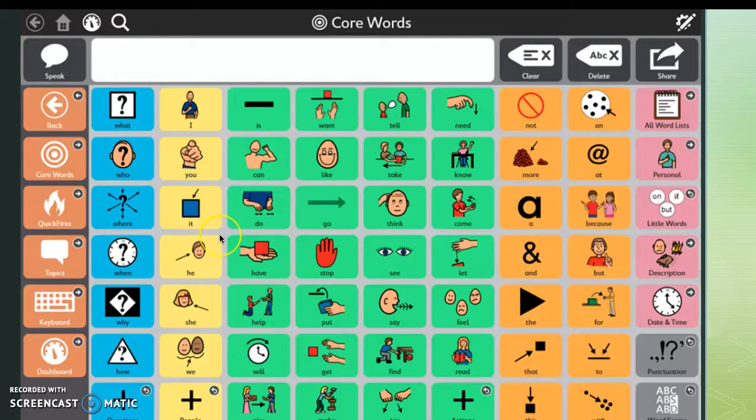the icons physically. And with this version, this kind of blew my mind, it wasn't something I was even aware was out there, but there's actually eye tracking technology so that an individual doesn't need to physically select the icons. It's super crazy stuff.